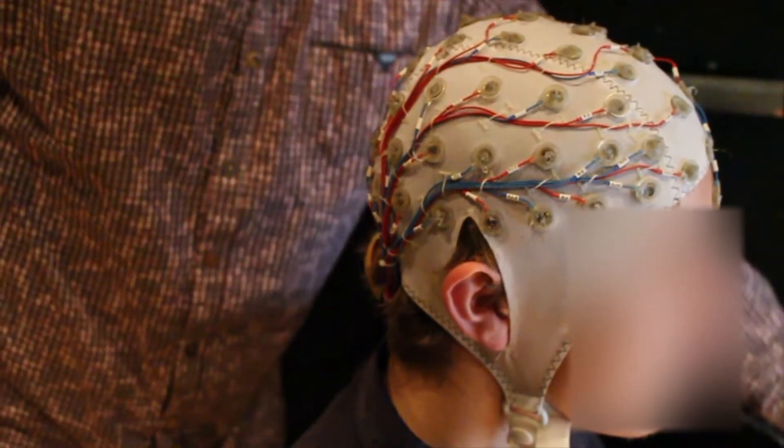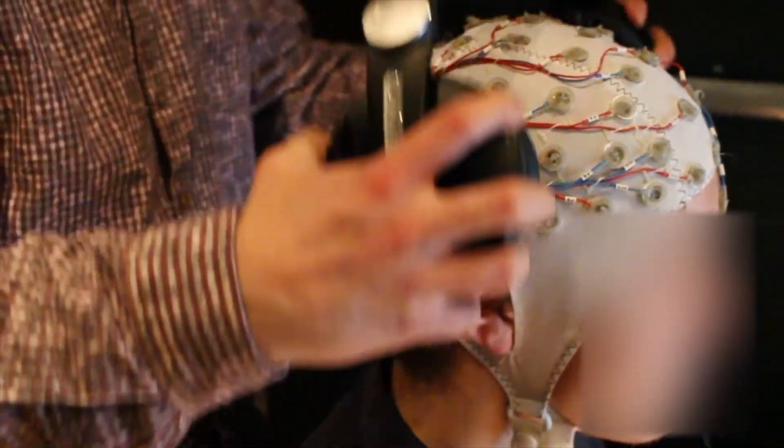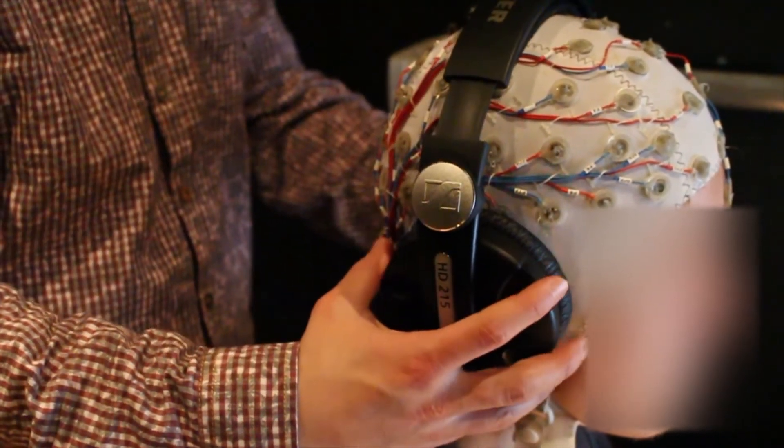If the participant needs to wear headphones for your task, first make sure that they are clean and then gently place them over the cap onto their ears.